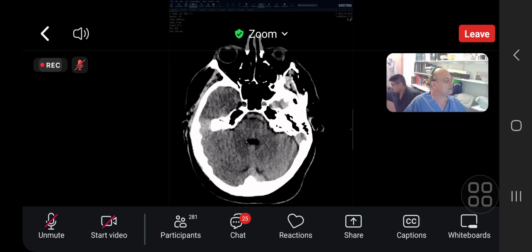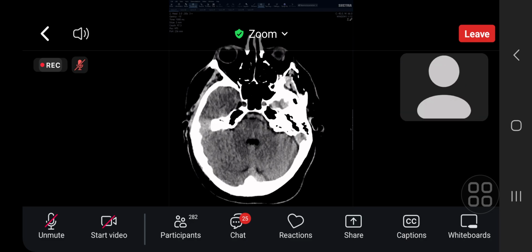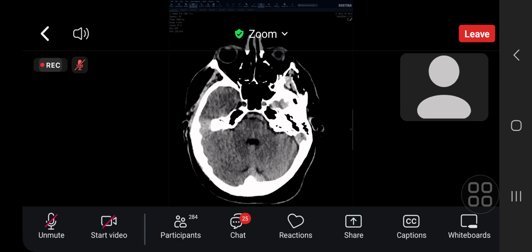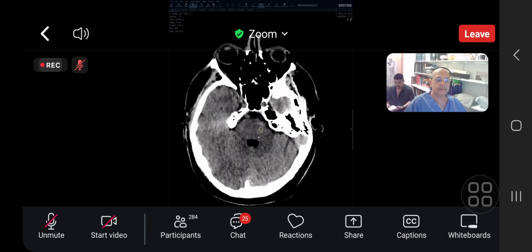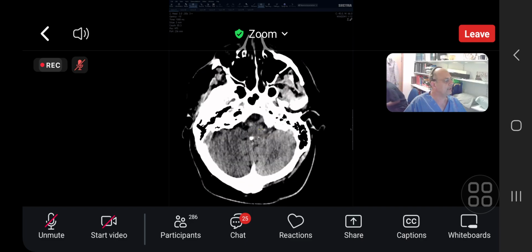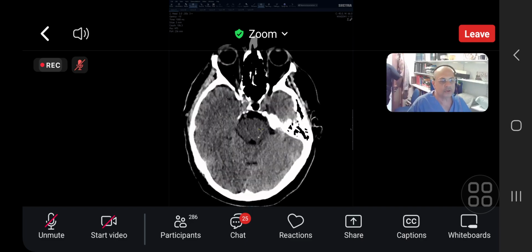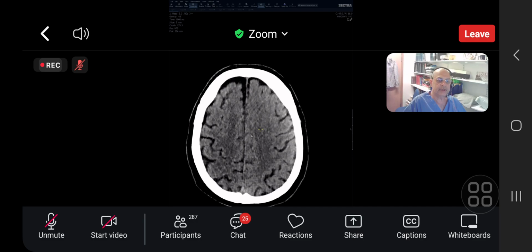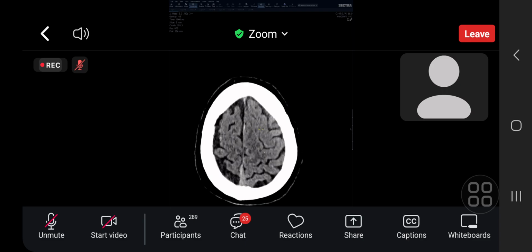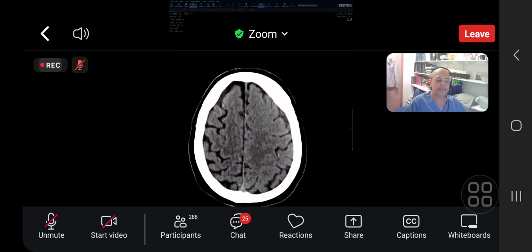So this is a patient who has come to the radiology department with a history of pelvic and visceral suspected injury, and this CT is part of the trauma series because there was a road traffic accident. So I will start from the vertex and I will gradually scroll for you so that you can see. Please tell me when you pick up something. So I will keep scrolling.